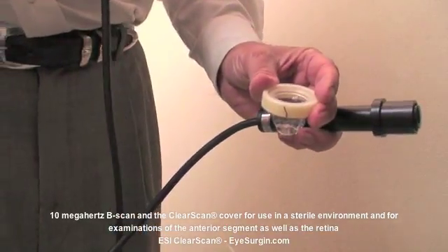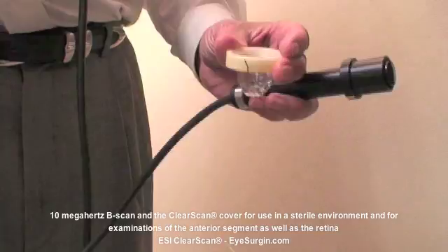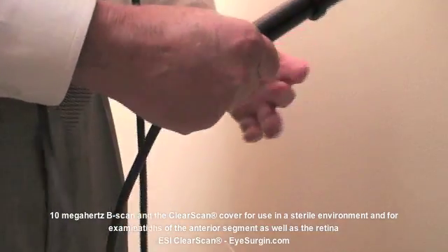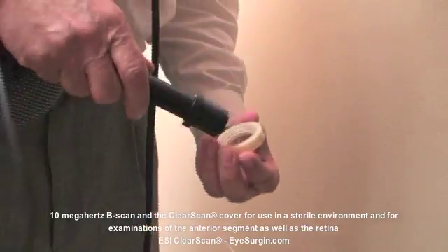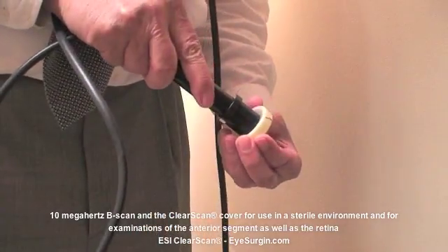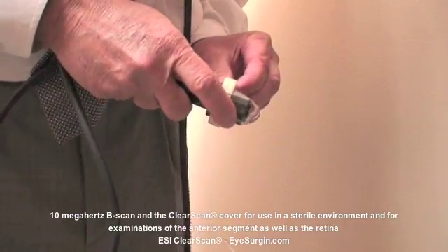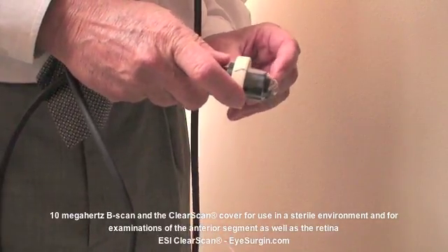The technique is different when conducting a retinal examination. Instead of filling the bag with water, add drops of viscous solution, such as Goniosol or Genteal, to the inside of the bag and push the probe all the way down to the bottom of the bag so that the probe tip is covered by gel.